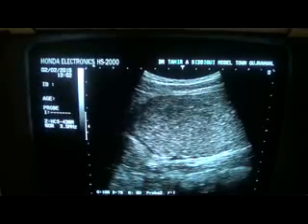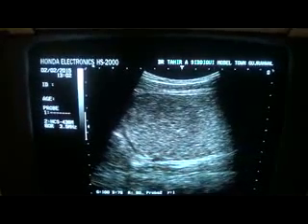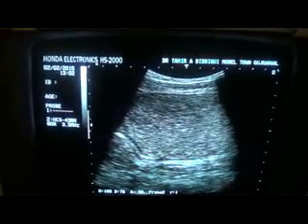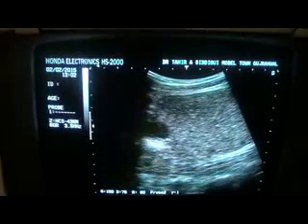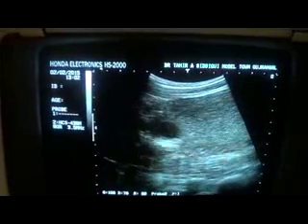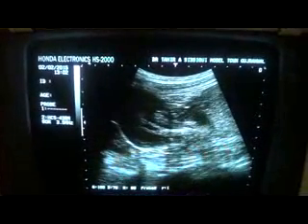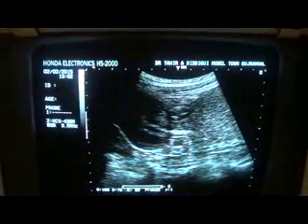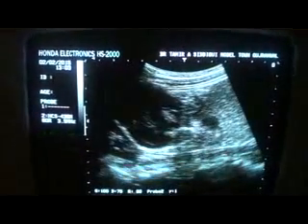I am placing the probe stable in this location. This is one of the many distended bowel segments, and meager, very slow peristaltic movements will be seen if I place the probe over here, and then again moving upwards, it becomes continuous with the thin walled cystic area medial to this.